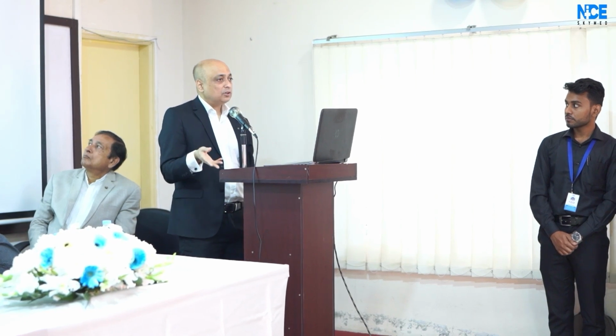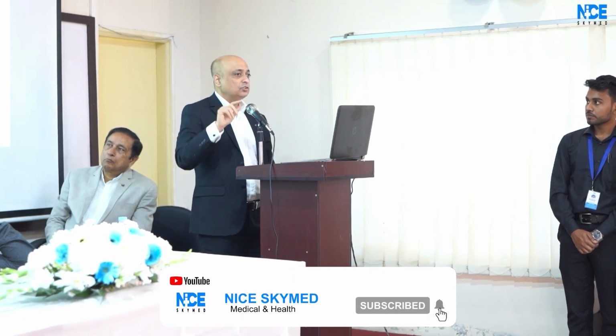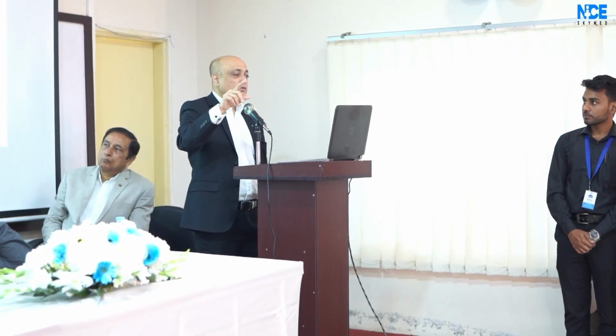You can't put a stent because platelets are low. He had portal hypertension. He had varices. One month back, endoscopy was done. He had varices. He bled. His hemoglobin was 8. What to do now? So we did this drug-coated balloon angioplasty. No stent. We put just a drug-coated balloon, and this is not an indication now. It is not a class indication because it is the main artery, but we did it for this case.